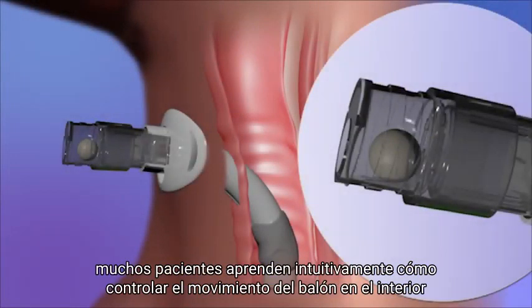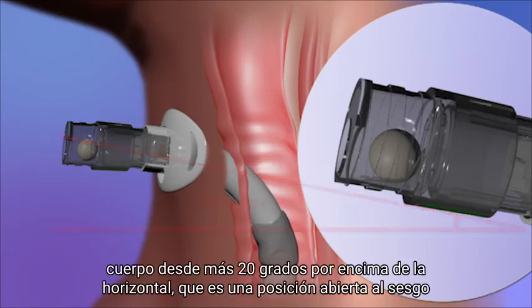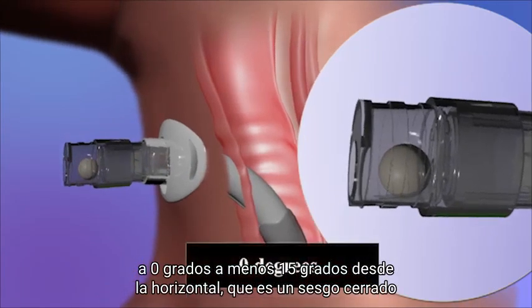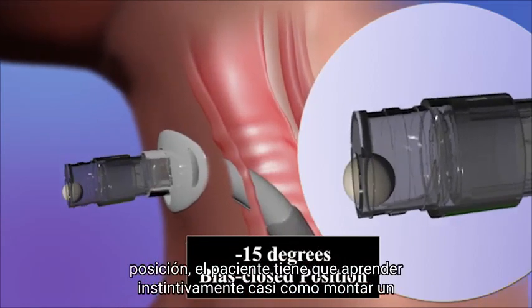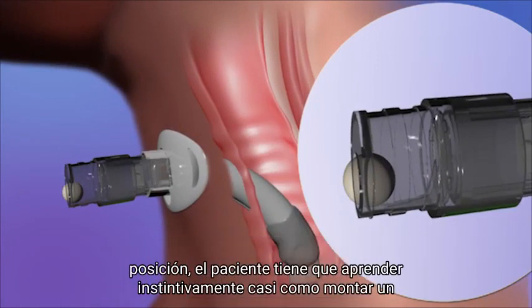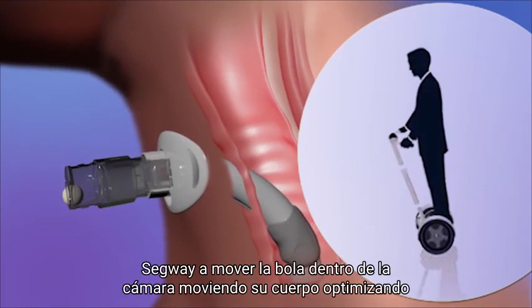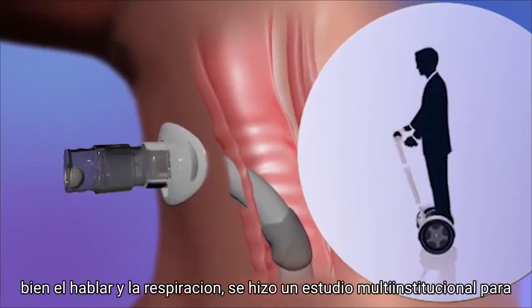With time, many patients learn intuitively how to control the movement of the ball inside the chamber of the Shikani speaking valve by changing the angle of their body from plus 20 degrees above the horizontal, which is a bias open position, to 0 degrees, to minus 15 degrees from the horizontal, which is a bias closed position. The patient hence learns instinctively, almost like riding a Segway, how to move the ball inside the chamber by moving their body, optimizing when to speak and when to breathe.